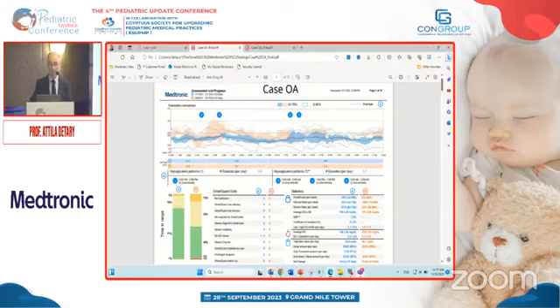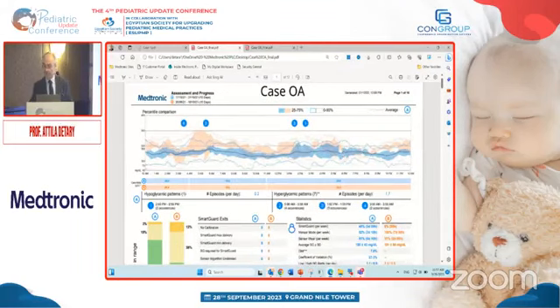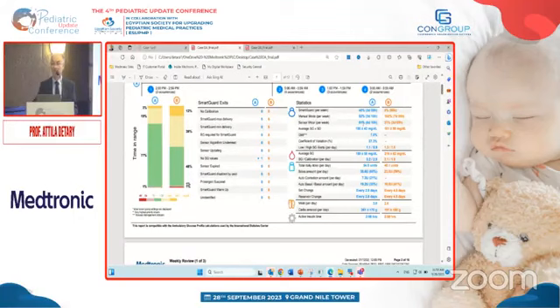So I would like you to focus on the statistics a little bit. So in the statistics, you see here, sensor use, line 3 in the statistics. In the reference period, the patient only used the sensor 31% of the time. However, during the last 2 weeks, the patient used the sensor 91% of the time, and half of that time was in manual mode, and the other half was in auto mode.